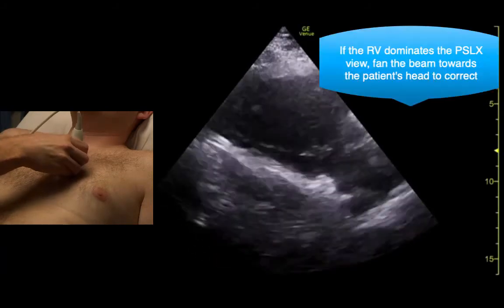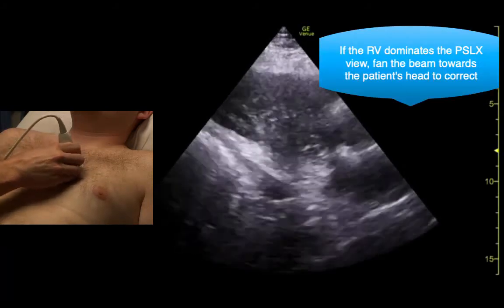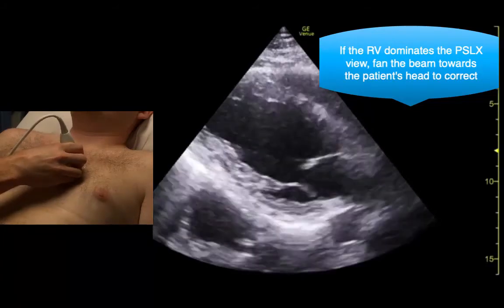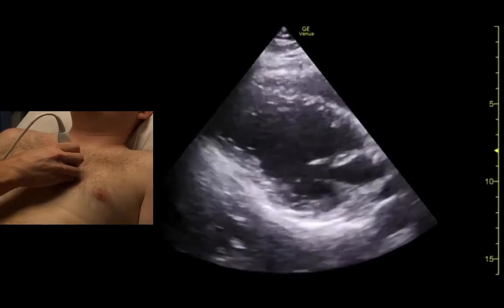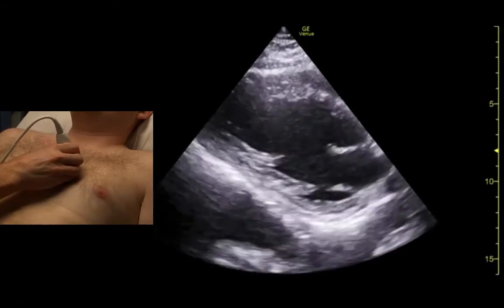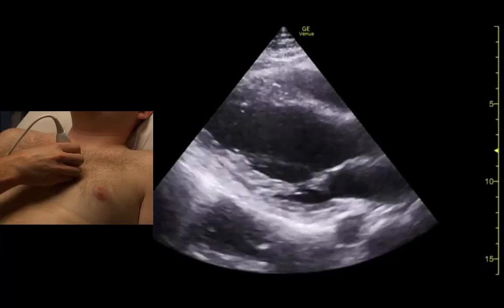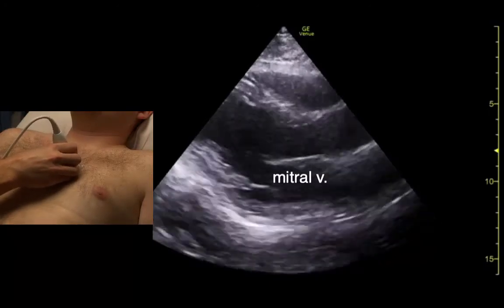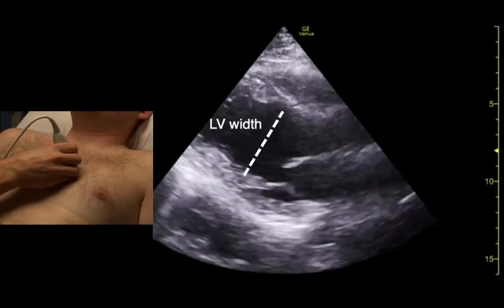If we want to fix that, we fan to the patient's head and then correct from there, so we get the aortic root, mitral valve, and the view.